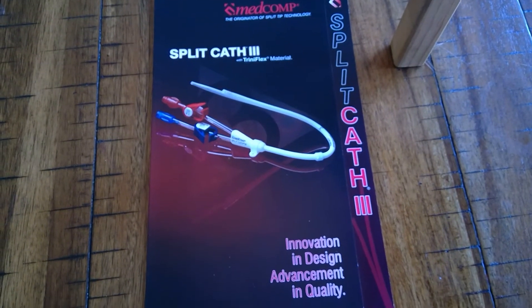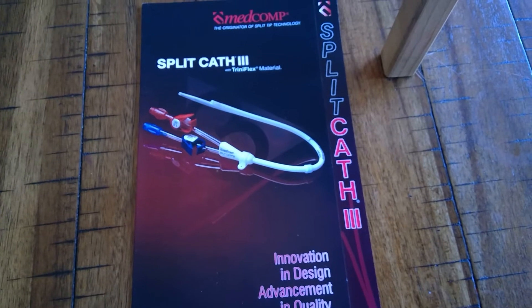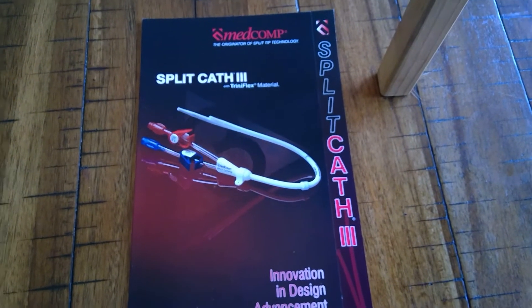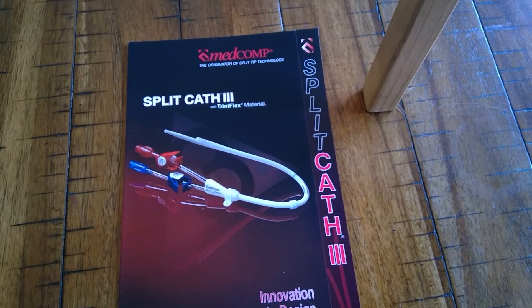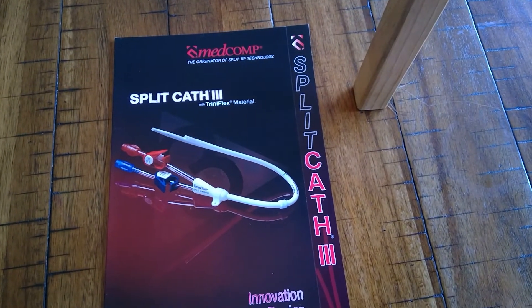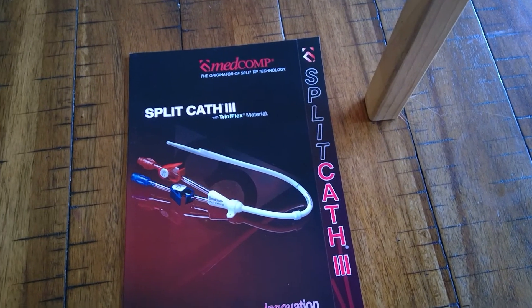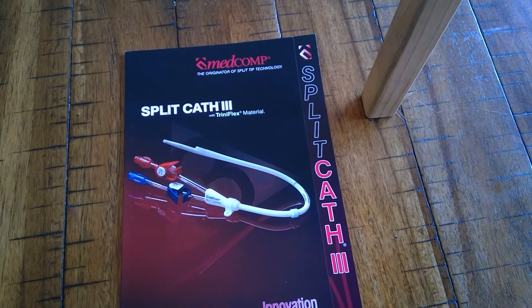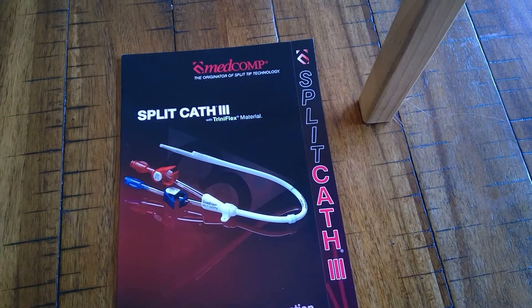This is the split cath long-term or permanent cuffed dual lumen dialysis catheter. Its innovative design has a customizable splittable tip. This is a split tip catheter versus a step tip — the two most common types. The most common type is a step tip. This is a split, and this particular one is the only one on the market that has a customizable tip.